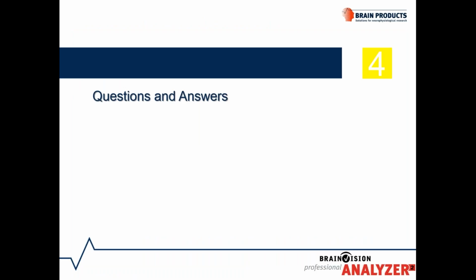Okay, before I provide you with the take-home message, I want to address some of the questions of interest that we received during the live webinar. The first question was, if I want to inspect the differences in the source activation map across conditions, is there an overlay feature for the activation maps?